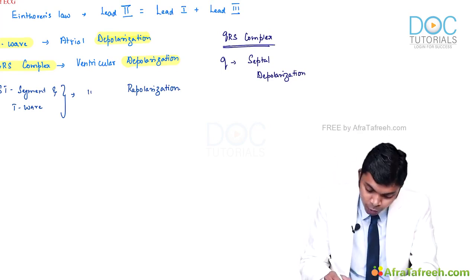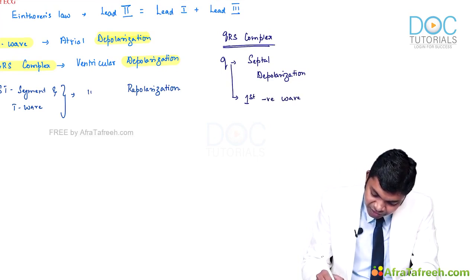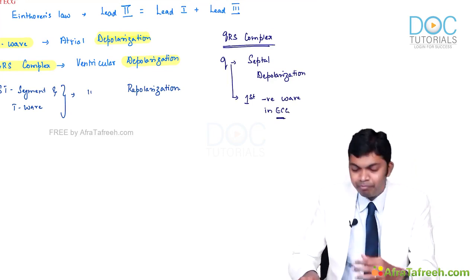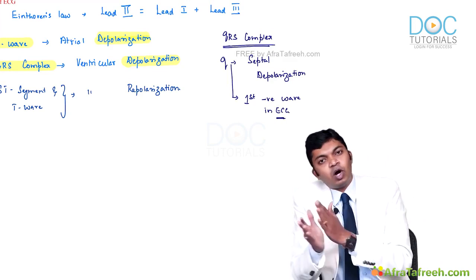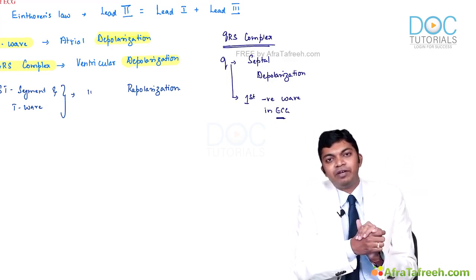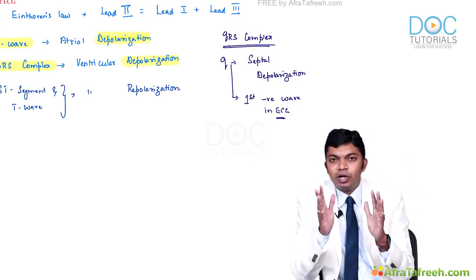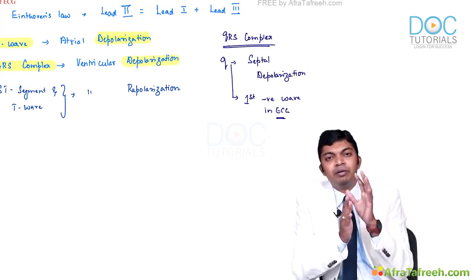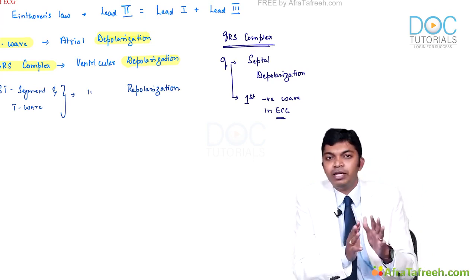Remember, Q wave is the very first negative wave in ECG. So the old concept that all depolarization waves are positive, with only the Q wave negative, is not so, doctors, right? Do not confuse the morphology of a wave with depolarization or repolarization.